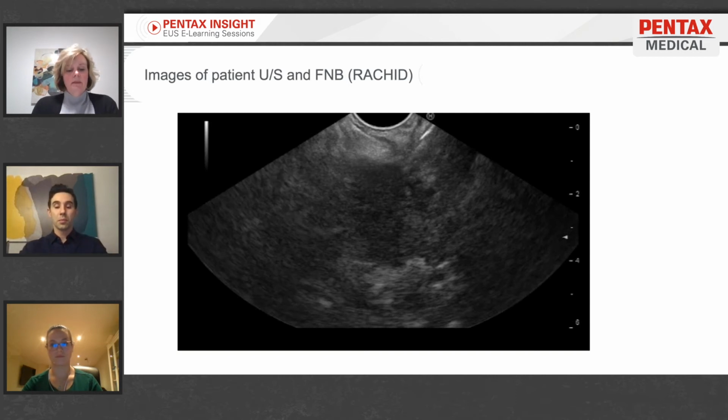To retrieve the specimen, the needle is advanced out of the sheath slightly and the stylet is reinserted into the needle. Inserting the stylet will cause the sample to be expelled from the distal end of the needle and a small drop is placed on the slide. If inserting the stylet does not expel enough of the specimen, air can be injected through the needle. Injecting saline in the needle at this point is not advised as it would dilute the specimen. After a slide is made, the remainder of the specimen is expelled into the medium.